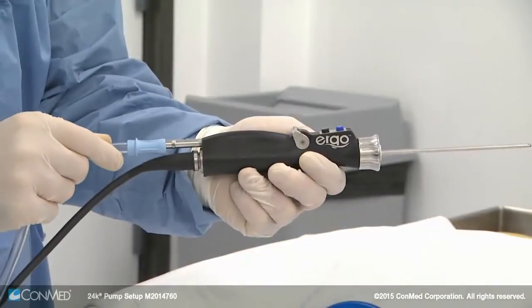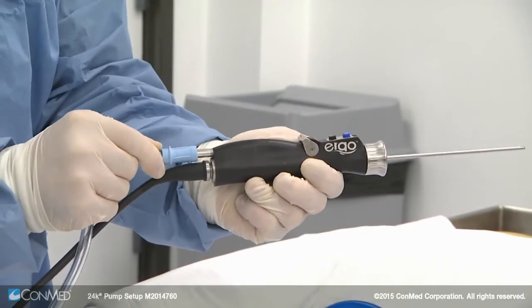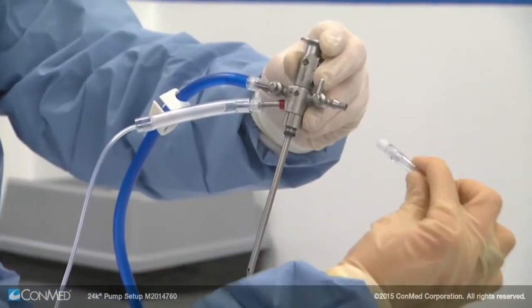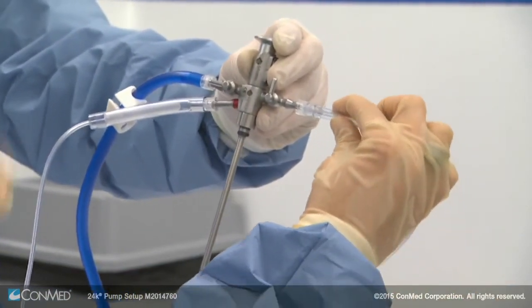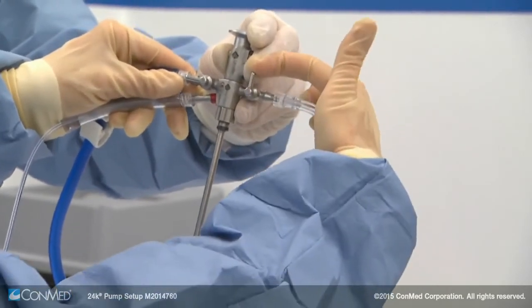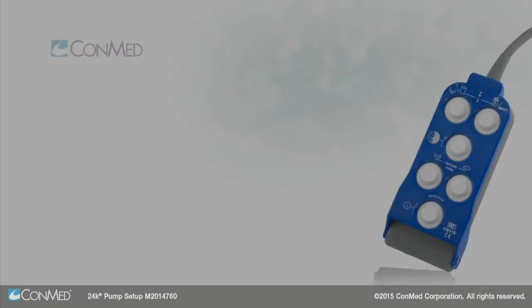Then install the shaver suction line, which is the clear line with the light blue end — push it in firmly to the suction port of the Ergo shaver handpiece. Using a dual stopcock scope sheath, install the outflow line to the outflow port and open the outflow lever to allow fluid to pass through. You're now ready to begin.